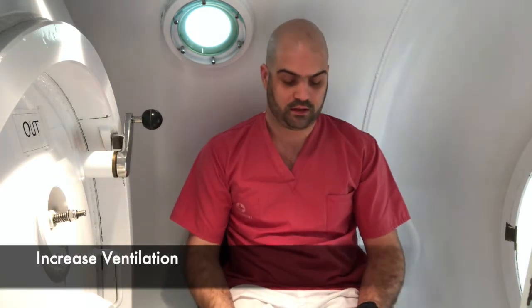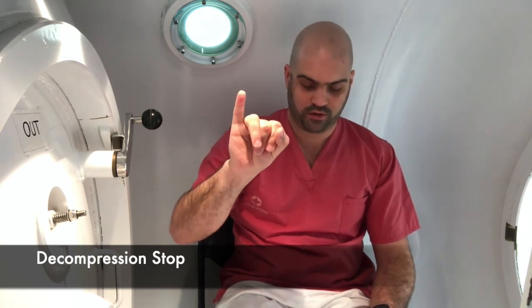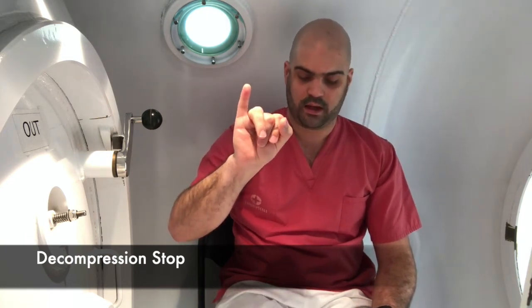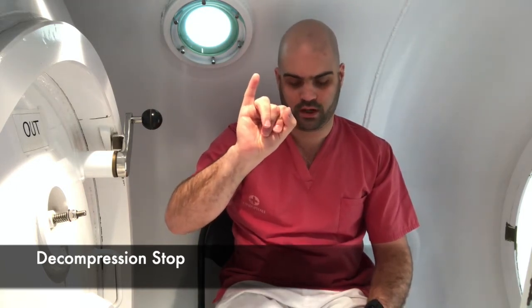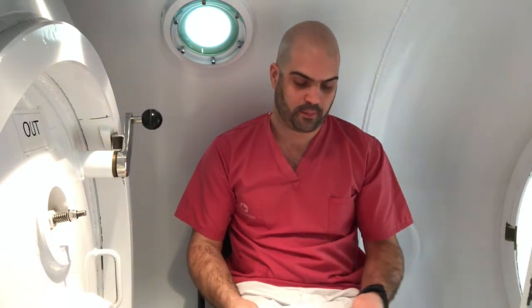If the temperature in the chamber is hot, or you need to change the air or increase the ventilation rate, then we have a signal like this, okay? You just do circle movements like this, and that will mean that you need to increase the ventilation. If you want to refer to the decompression stop, we do it like this, and we also use this signal to ask how much time is left in the decompression, okay? This is something specific for the operation in this service.